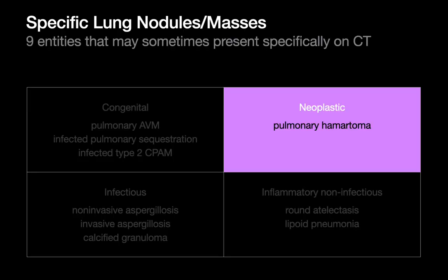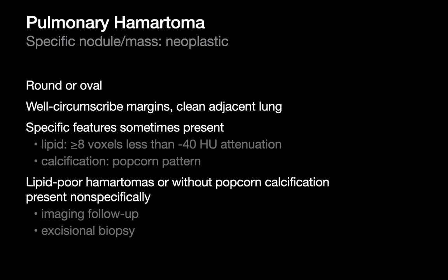Moving on, there is one entity in the neoplastic category that can present specifically, and that's a pulmonary hamartoma. Pulmonary hamartomas are generally nice, well-circumscribed nodules. The lung adjacent is very clean — it's unusual to encounter a ground glass halo around these. They tend to be ovoid in shape. Sometimes some of these will present specifically. The most specific feature: the more lipid-rich ones will actually present with macroscopically visible fat inside the nodule. There's nothing else that would look like this — if you see a nodule with macroscopic fat within it, that's pretty specific for a pulmonary hamartoma.